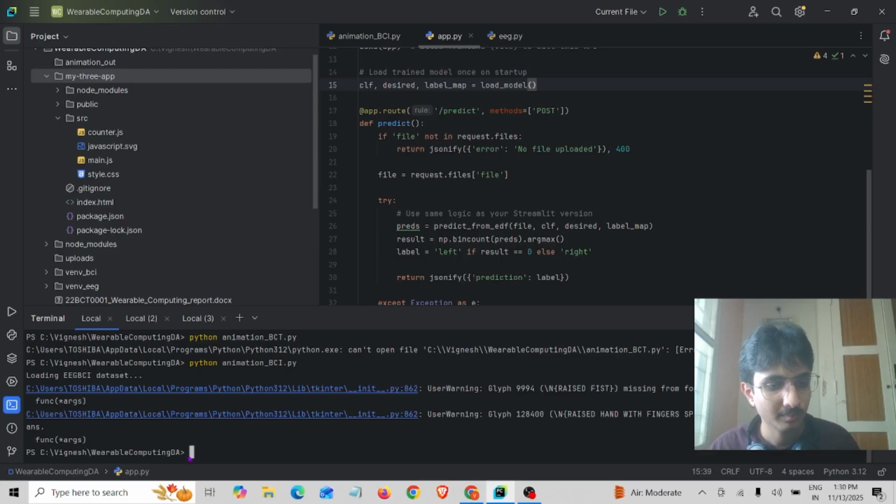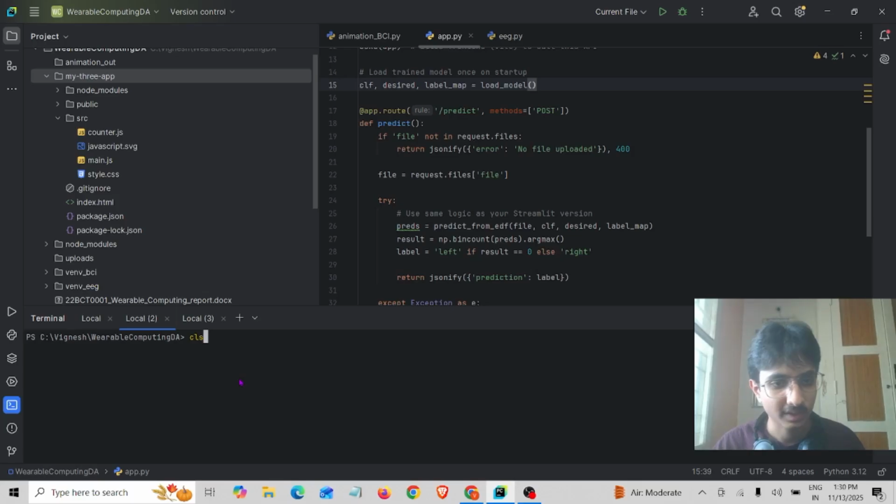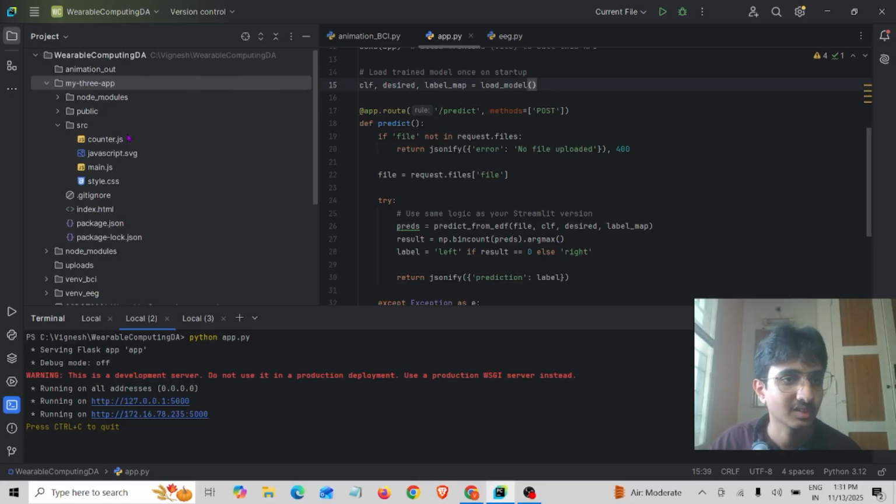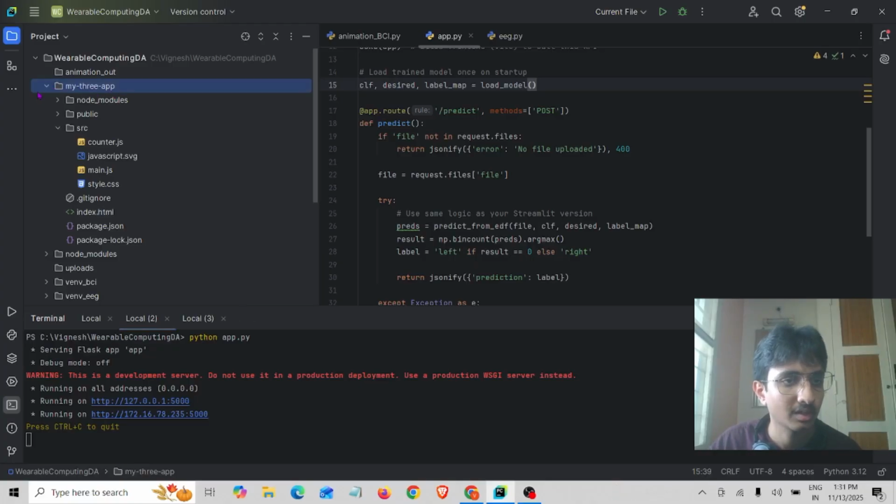I'll be running the Python code over here. This is the Flask server which will receive the EDF files. After that, we have also made a 3D model to make the output more intuitive. We connect the ML predictions to the 3D animation built using Three.js. Let me show you that as well.